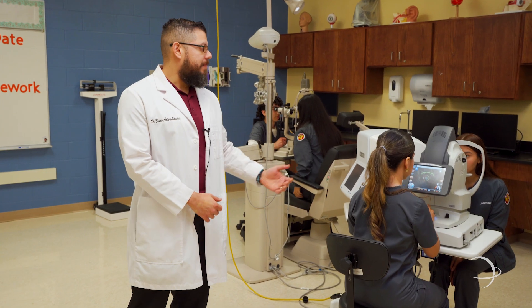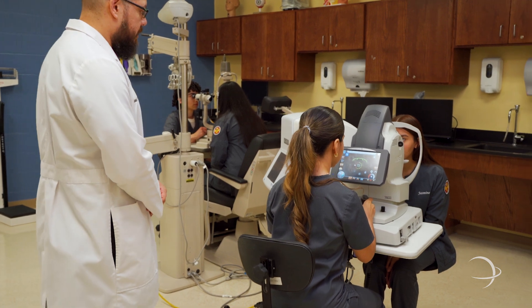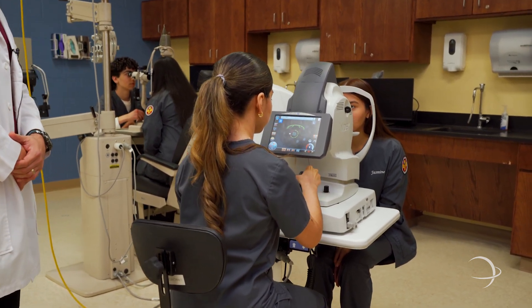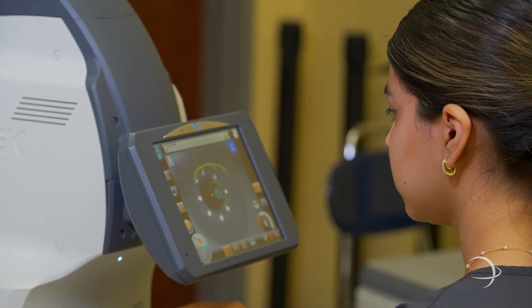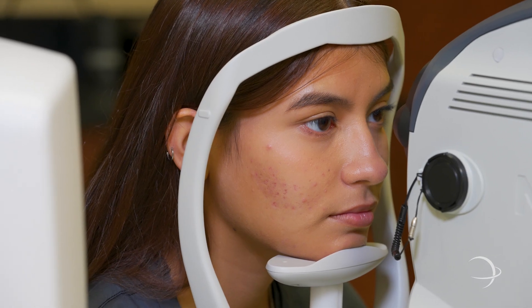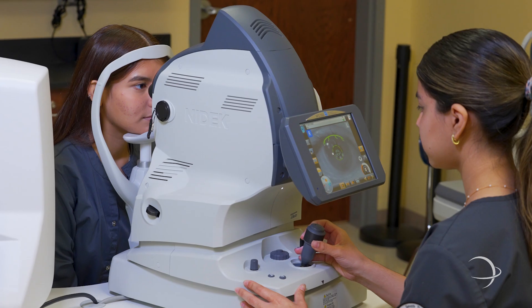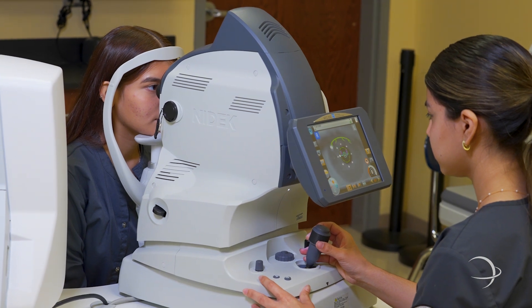To my left, we have the fundoscopic camera. What this device does is take a picture of the back of the eye, so there's a more explicit view of the retina. The tech is responsible for lining up to the pupil and making sure that a picture can be taken successfully, and it's completely painless to the patient.